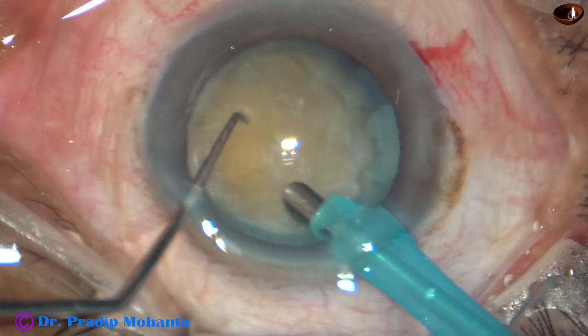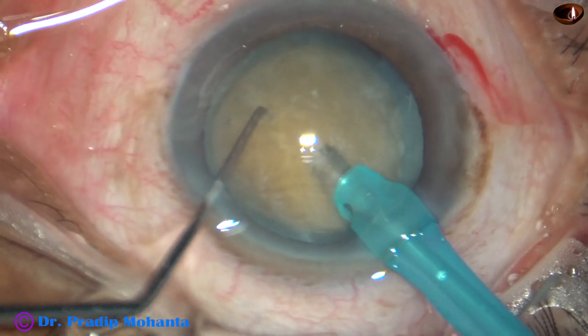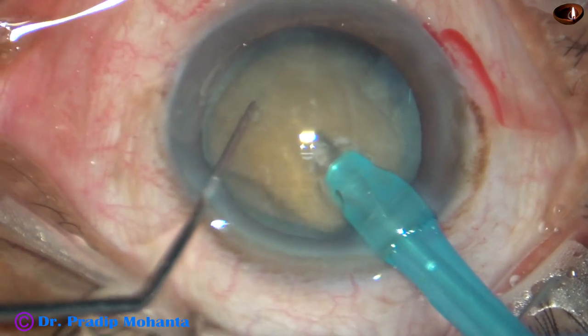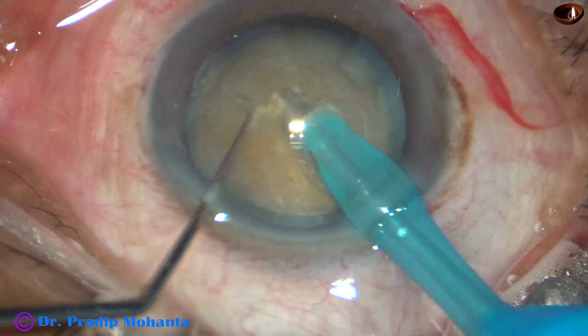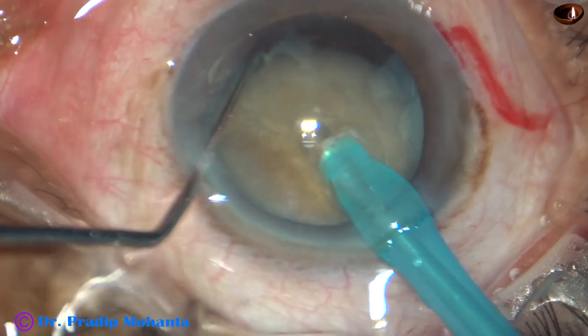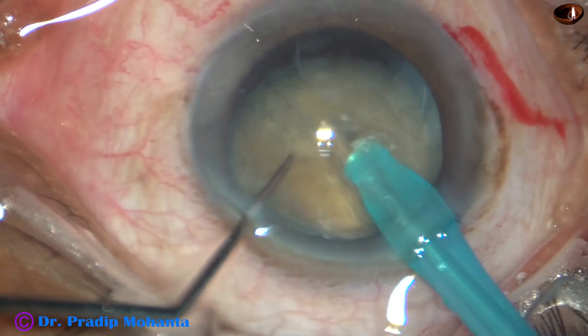The epinuclear material is removed and we see a free-floating hard nucleus. In such cases, I usually try to divide the nucleus with bevel down, because in the bevel-up position it is very difficult to embed the tip of the phaco needle into the substance of the nucleus.